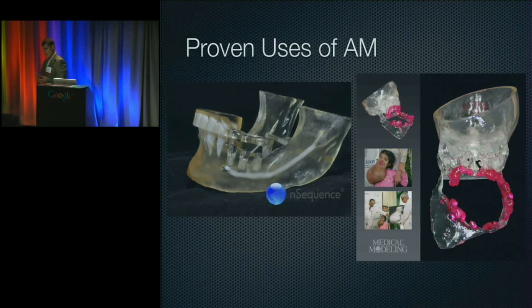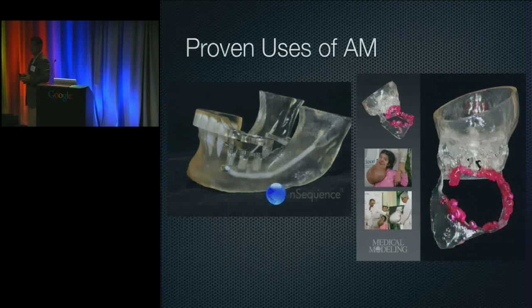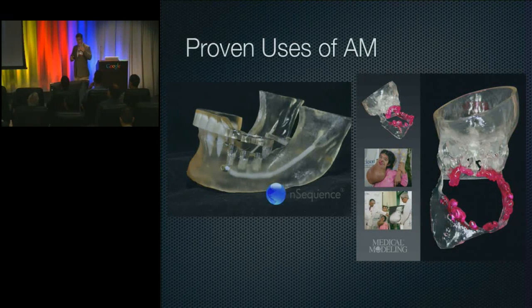Specifically, I think we've seen some applications talking about aligners for dental and orthodontics. There are some really cool applications in dental that are pushing all of this forward. I'm mostly going to stay away from dental specifically because we're more focused as a company on medical technology. So really surgical planning and people getting hips and knees and parts of their jaws reconstructed after tumors and such. These are typical applications of the past: big surgeries, surgeries where we're seeing large defects, and surgeons really need something physical.